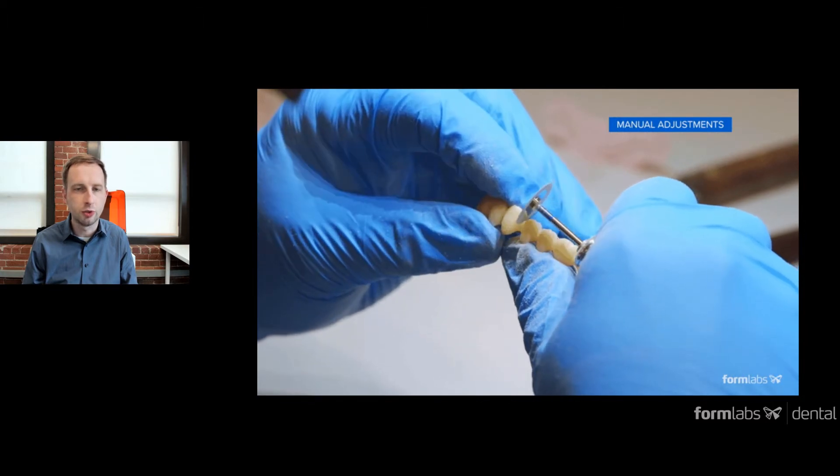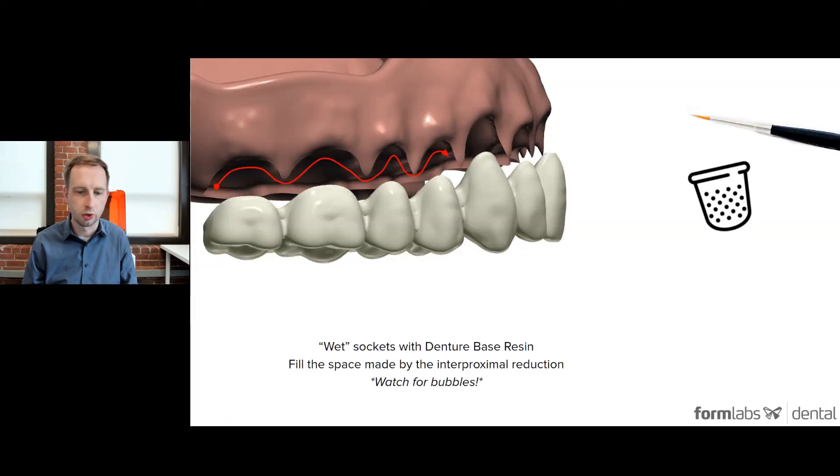During the assembly process, after the reduction and support removal, you take the base resin or gingiva resin, wet the sockets, squeeze together, and use a handheld UV cure light. When you reduce the interproximal connection, that leaves a little bit of a void. In this process, you want to make sure you have enough resin to fill in those voids and spaces — you do not want a hole in the middle of your part. Make sure there are no bubbles; get all the bubbles out because you don't want any pockets.